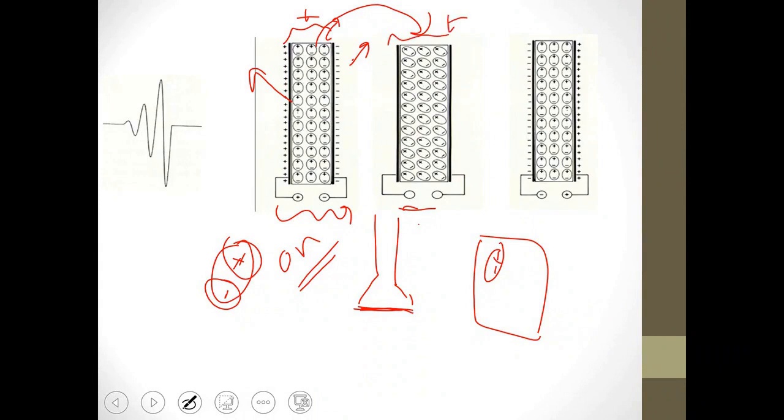Then I can apply the electric field again, but this time I reverse it, making the negative charge positive and the positive charge negative. It's as if you are reorienting the molecules or dipoles again. I will repeat this process quickly. You are reducing the thickness and then increasing it, reducing the thickness and then increasing it. This reduction and increase in thickness means you are changing the thickness of the crystal itself.